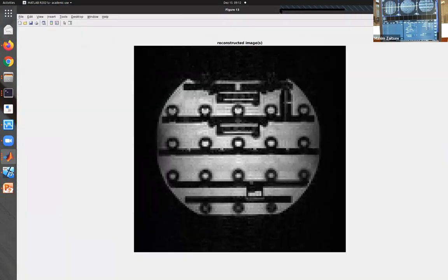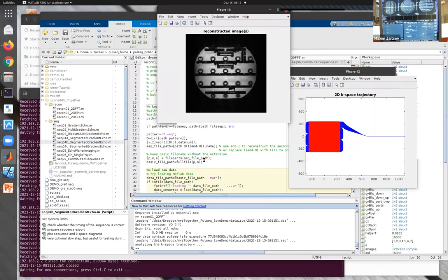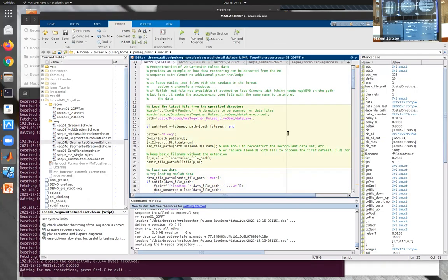Here is the image. So it's a low resolution, high bandwidth, multi-segment FLASH. So I can go on. We can do a next step and try EPI, or you can go through the materials offline. That's probably better if we answer some questions at this point. Are there any questions?